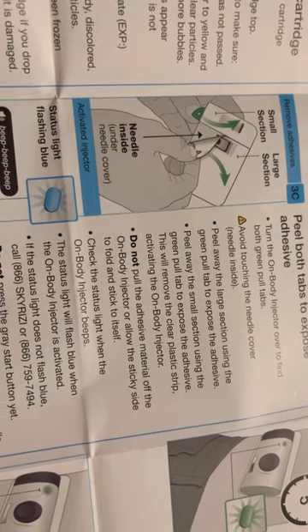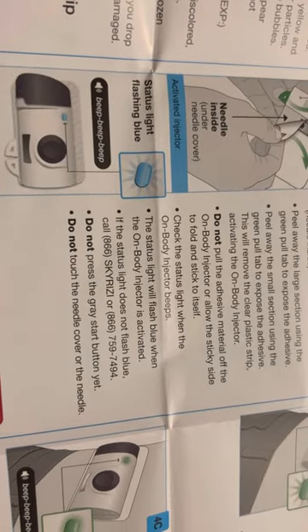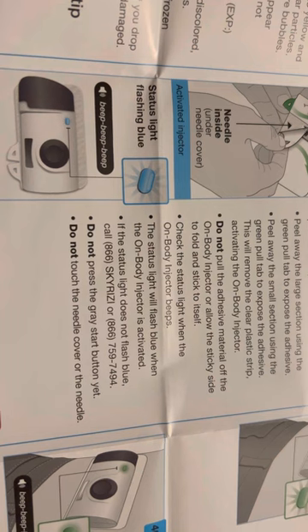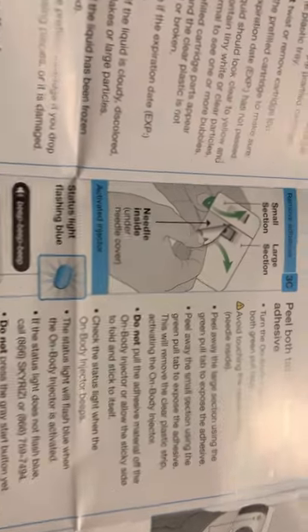Pulled that big part off — peel away. Check the status light. When you pull that second small tab out, I think that's when it starts to turn blue. Yep. So the big one's off, and you don't close this — don't close it. This is going to peel that off.